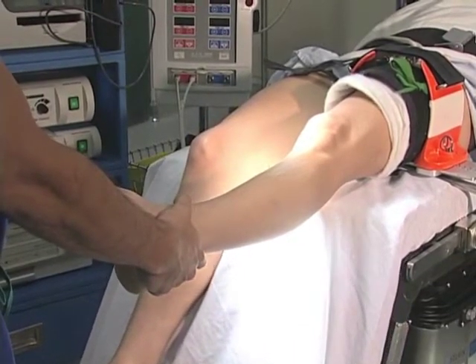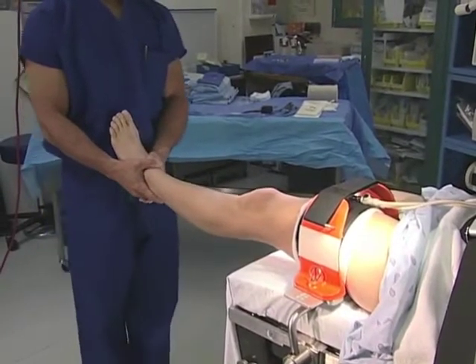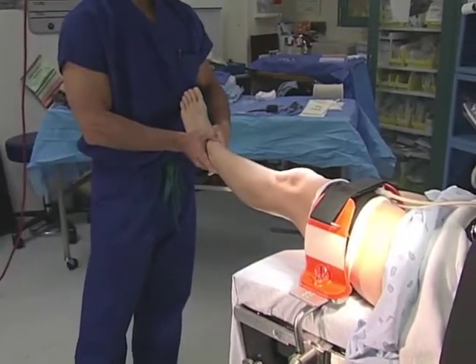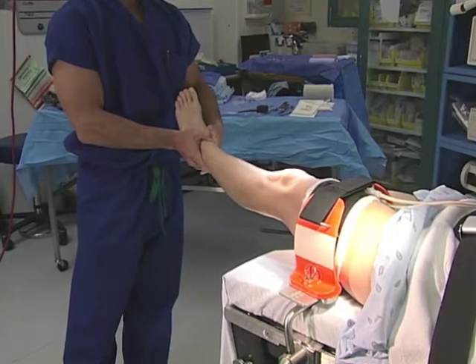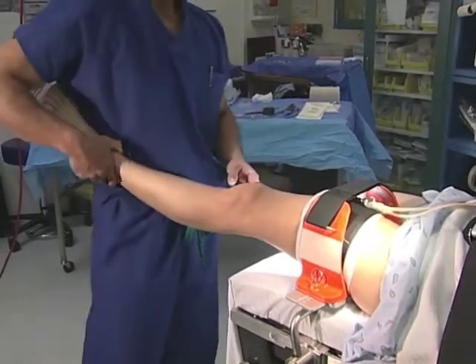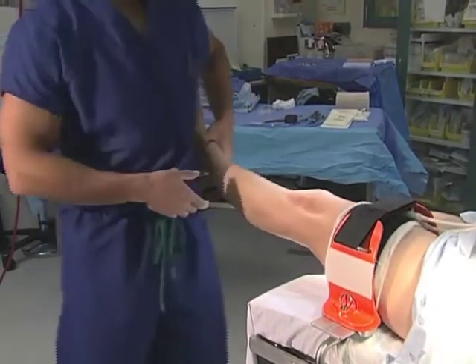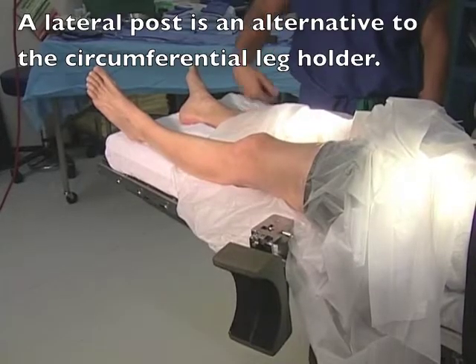A surgical assistant holding the leg may push the leg laterally or into valgus to expose the medial compartment, and medially or into varus to expose the lateral compartment. If a surgeon is operating without an assistant, the surgeon may push the leg on his hip to position the leg into valgus for the medial compartment, or varus for the lateral compartment. The lateral post is then locked into position.